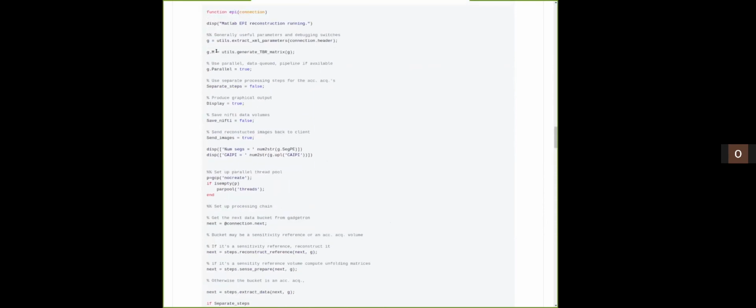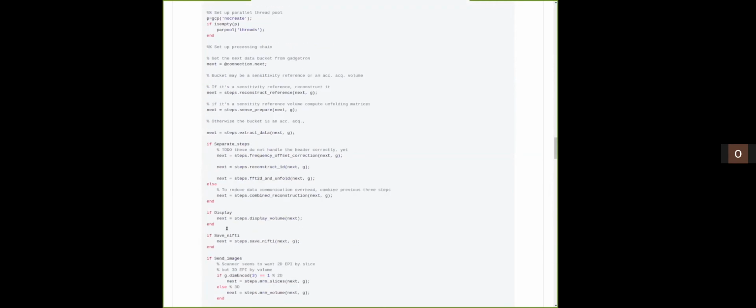So some sort of global that can be passed down to functions seems useful. You can also have other switches that only have scope within this overall function. So for example, if I want to have my displays appearing on the X server from Matlab while it's running, I can just have a conditional.